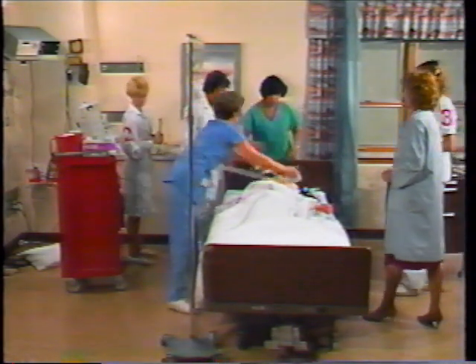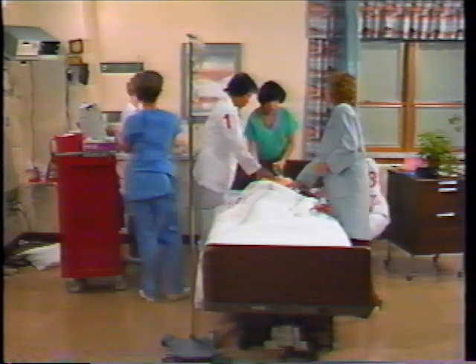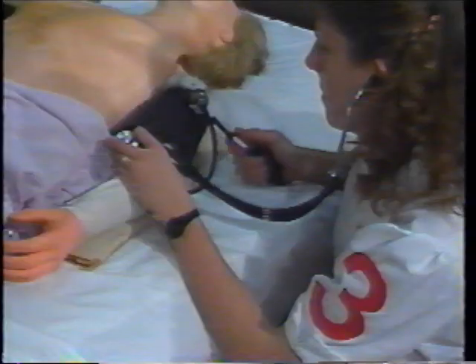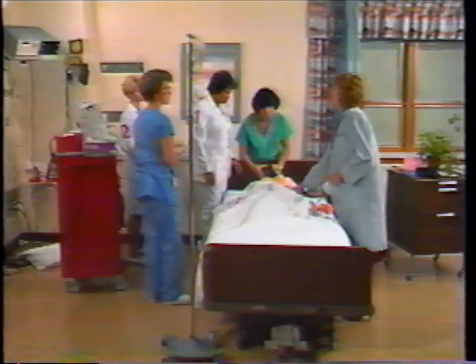Wait, she has a rhythm. Junctional tachycardia. The response is junctional tachycardia. Blood pressure. The patient has a palpable pulse, so compressions are stopped. Nurse number 3 checks the blood pressure and finds the patient hypotensive.